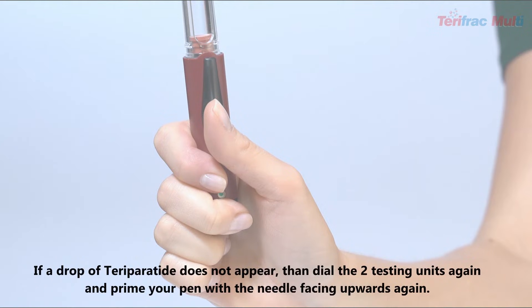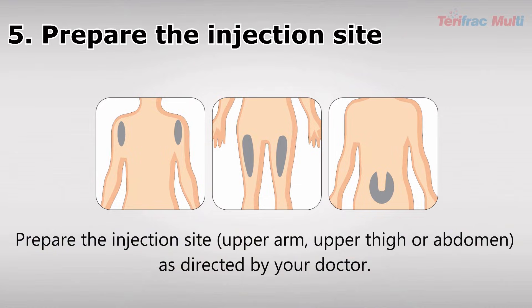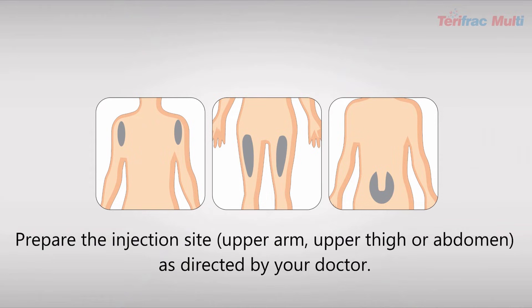This signalizes the end of the injection. You should see a drop of Teriparatide at the end of the needle. If a drop does not appear, dial the two testing units again and prime your pen with the needle facing upwards again. Prepare the injection site — upper arm, upper thigh, or abdomen — as directed by your doctor.